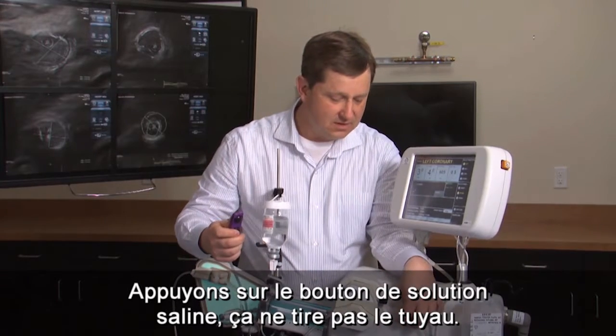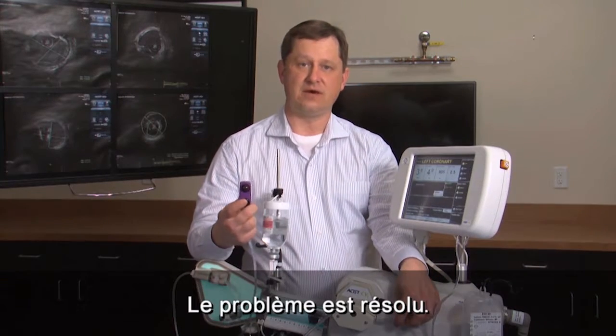Let's press the saline button again. It's not pulling the tubing in, so that resolved your problem.